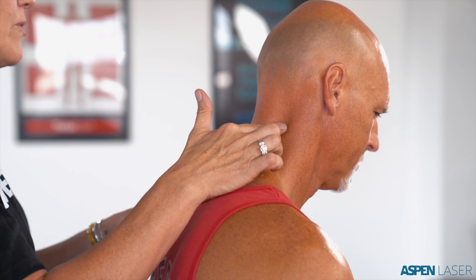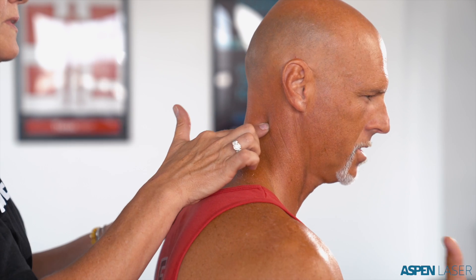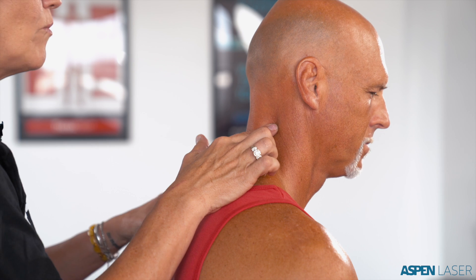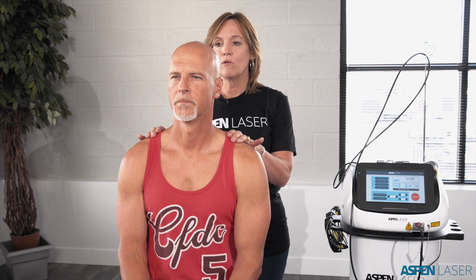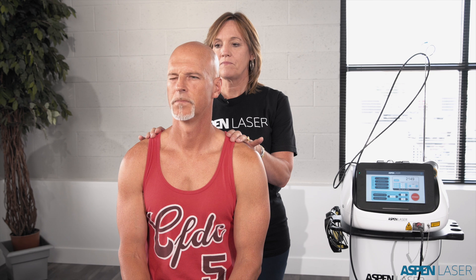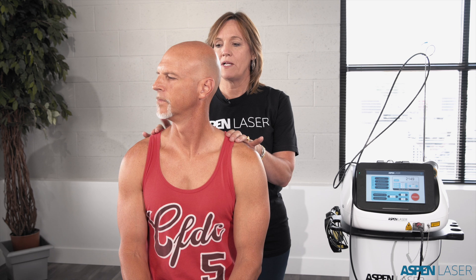Is there any motion that increases that pain without further aggravating the condition? Turning my head to the right. Go ahead and with your shoulders square, turn your chin to the right and close your right eye for me. Go as far as you can and tell me where it starts to feel more uncomfortable. Right there. What's your pain scale at that position? Eight.